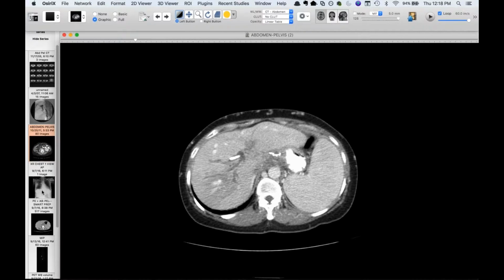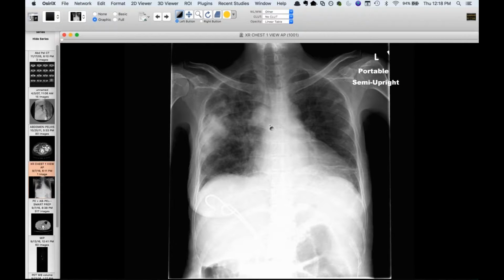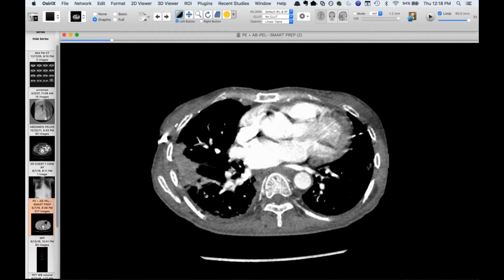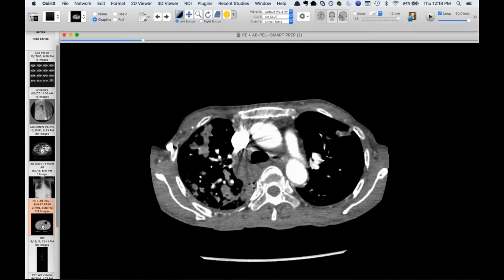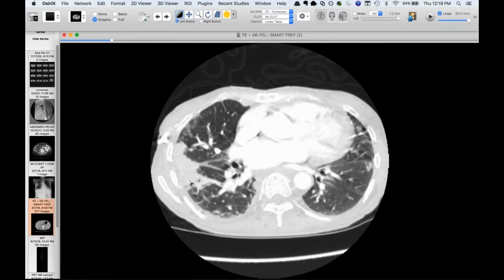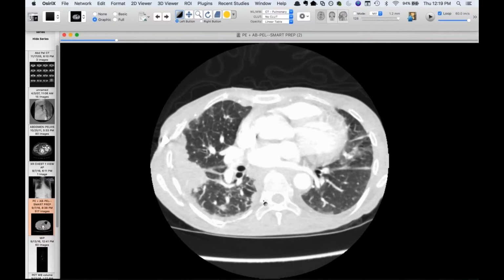And then she came into the ED this year, and now she's got this consolidation on the right, some nodular foci consolidation on the left, and the question was, does she have pneumonia? Does she have something else going on? I thought maybe she had some lymphadenopathy here. Then she got the PE study, and check out her lungs here. So it's been several years, and I think this is all just her dilated azygos arch. But I certainly was not crazy about the pneumonia once I saw this CT. I think this is much too mass-like.